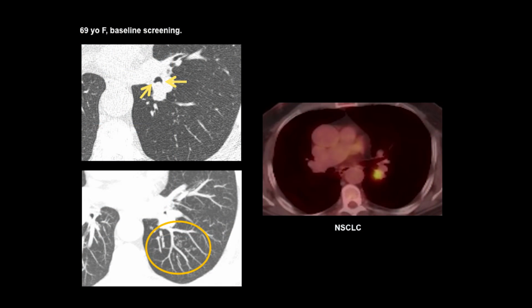Another thing about endobronchial lesions, and this is a case that one of our community radiologists picked up, which was great. You can see there is this filling defect here in the bronchus, and you can really pass through this without contrast. It's very easy if you're in a rush. But notice how the borders are convex. Another thing that might tip you off is that distal to that, there were tree-in-bud nodules.